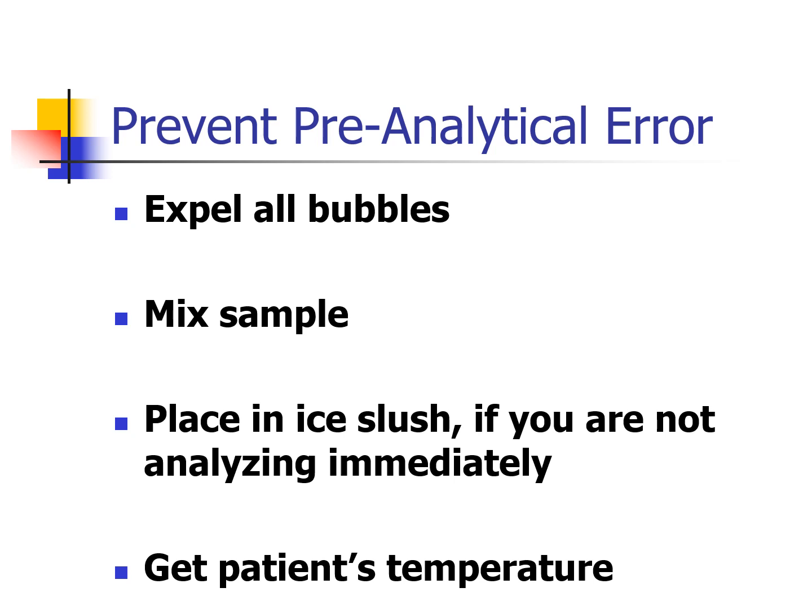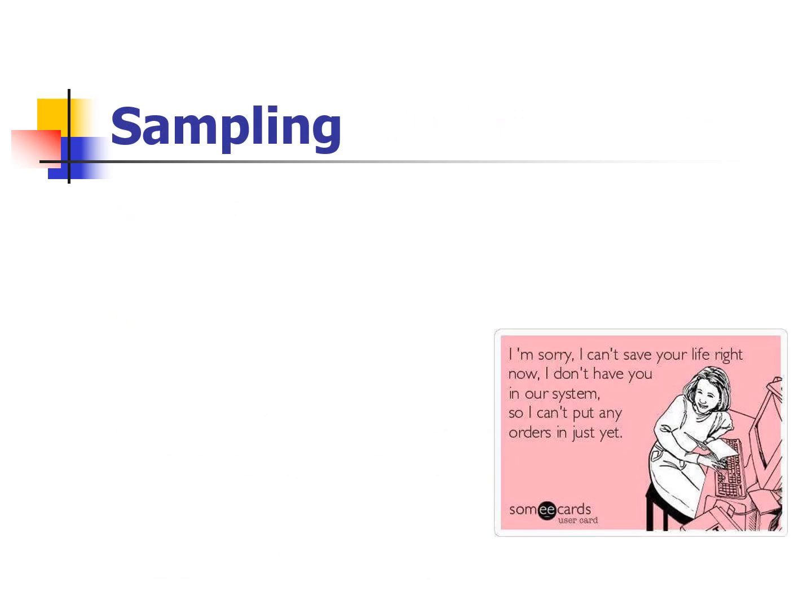Get the patient's temperature. That's what that whole last slide was about. That's what you had to listen to me all that about. Get the patient's temperature, otherwise their PO2s are going to be off. If the patient's hyperthermic or hypothermic, it'll throw off the accuracy of the PO2s. Well, what's one of the indications for blood gas? Looking at their PO2s, right? So you don't run it immediately. You need to put it on an ice slush, right? That's going to be one of the big things here.